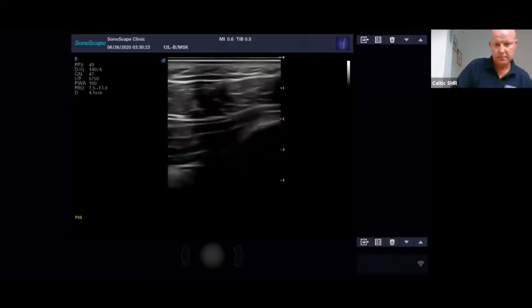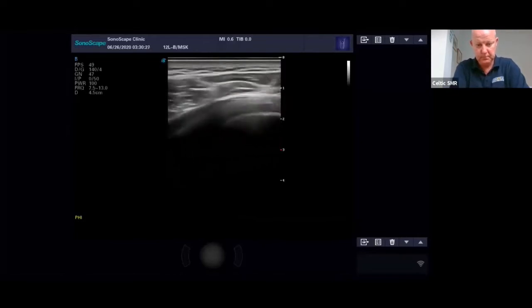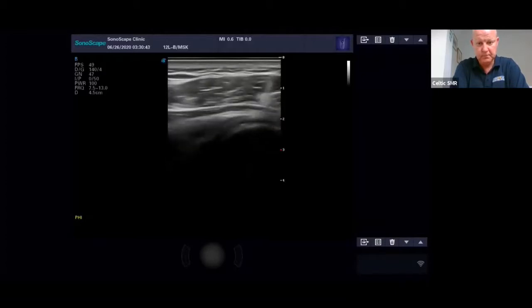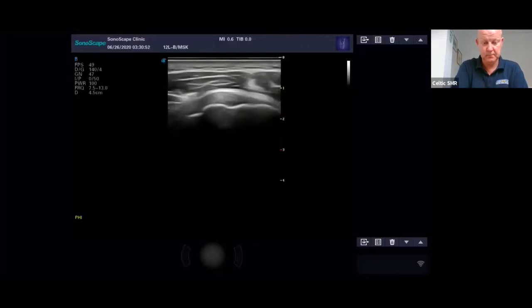One thing to be aware of, if you do have a full rupture, you'll get superior migration of the humeral head, and that has the effect of bringing teres minor up as well. So you can confuse that with infraspinatus, and you think, oh yeah, infra's intact, but it's actually just because the teres minor has come up and been in your view. So that's one thing to look out for.